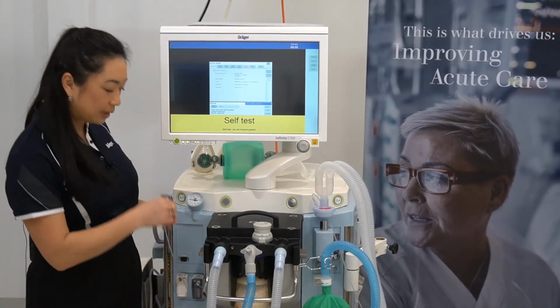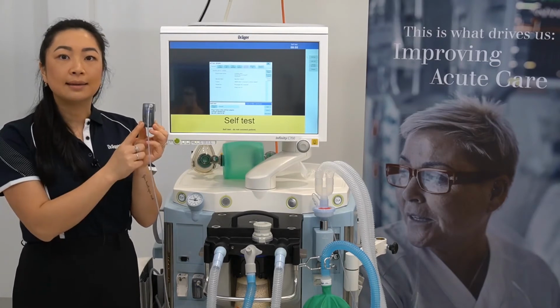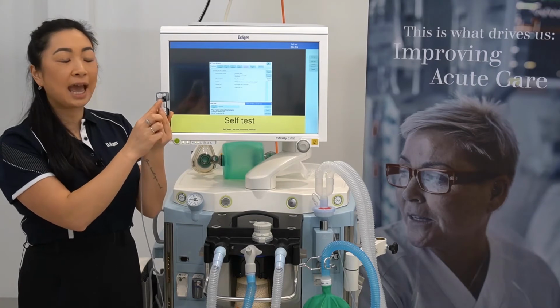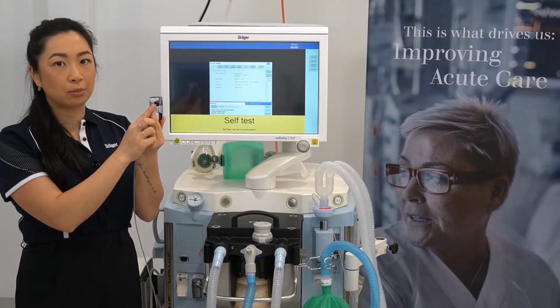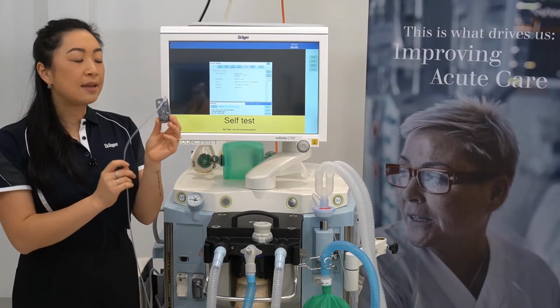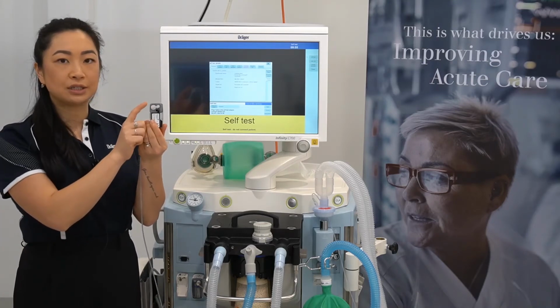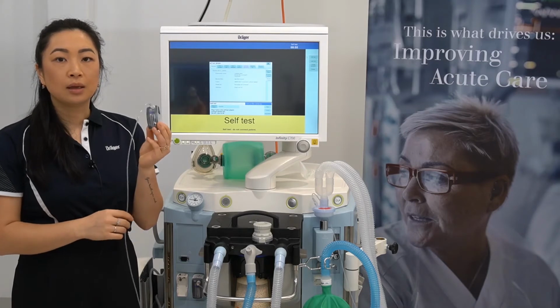Then verify that the orange marker is between the two black lines to indicate adequate scavenging. To check your breathing system is connected and locked and the breathing hoses are okay, visually inspect that the lateral twist locks on either side are in the horizontal locked position. Then ensure that your hoses are securely connected to the ports.